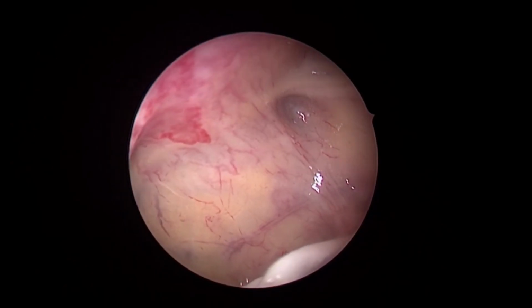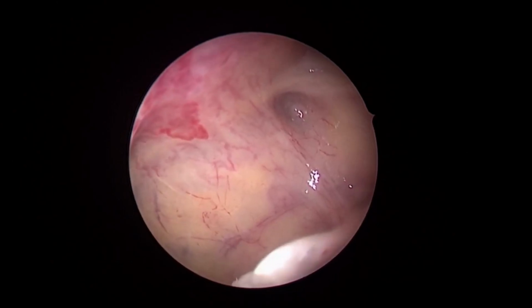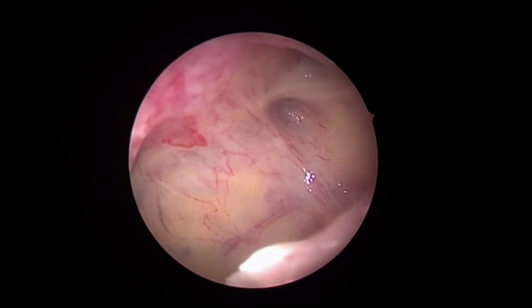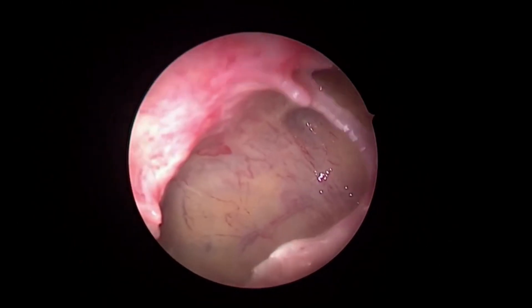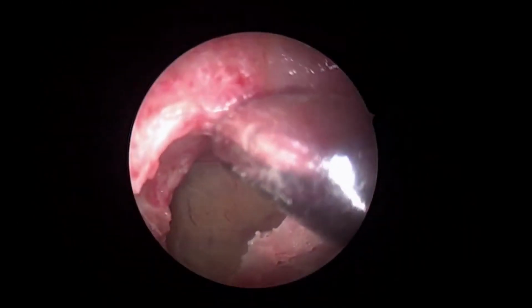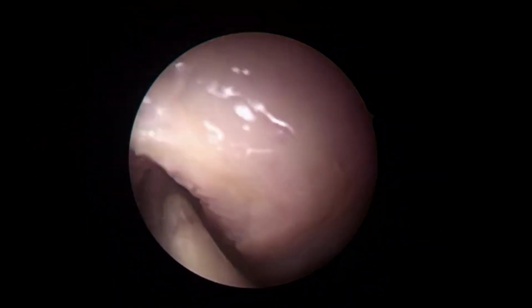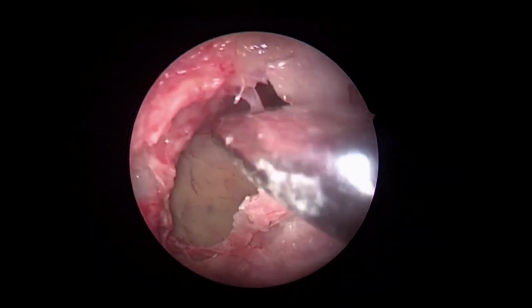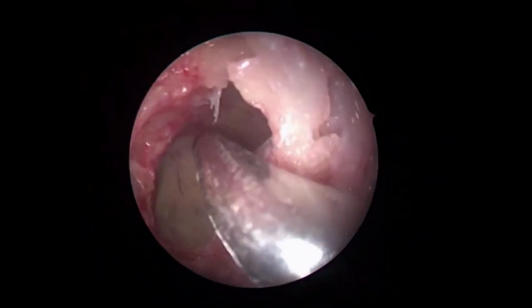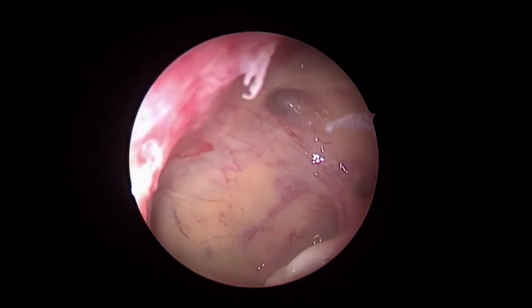That is the infraorbital neurovascular bundle in the roof. And we'll dissect it when I come to the maxillary sinus later, in expanded approaches. I will show how important a landmark the infraorbital neurovascular bundle is. And we'll show a technique nowadays: even you can go beyond that endoscopically by means of transposing this entire neurovascular bundle.